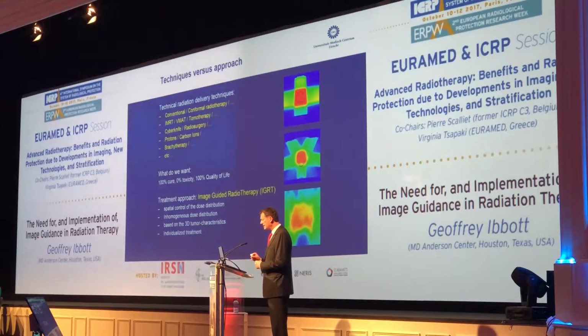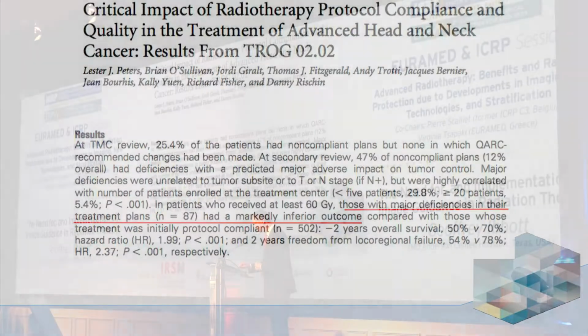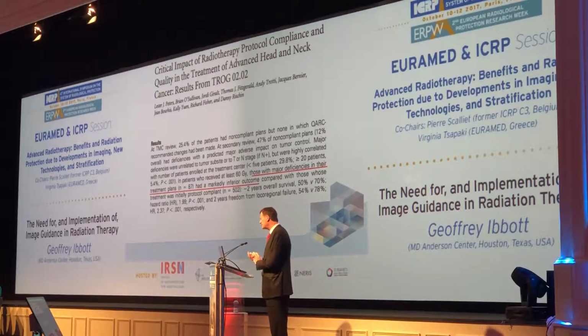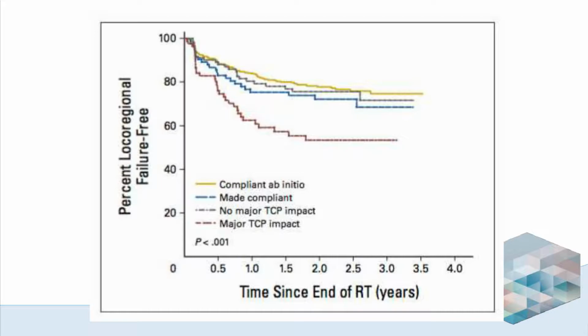And image-guided therapy contributes to that by helping us see what it is we're aiming at and trying to treat and what it is we need to avoid. I'm going to point to a couple of articles here, one of which Dr. Gregoire also mentioned. And so I will only remind you, as he did, that this study, in part, demonstrated how important the quality of radiation therapy was. And what he didn't mention was that, in fact, the poor quality of some of the radiation therapy delivered on this trial masked the benefits of combined chemotherapy and radiation, which was actually the goal of the study, to demonstrate that.